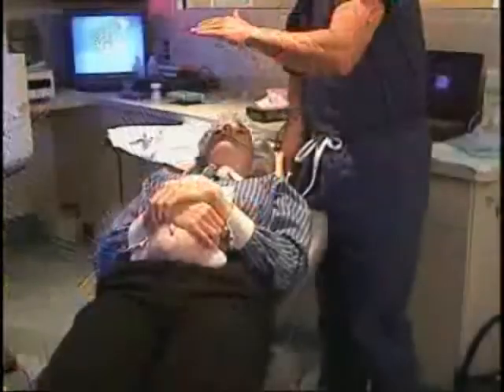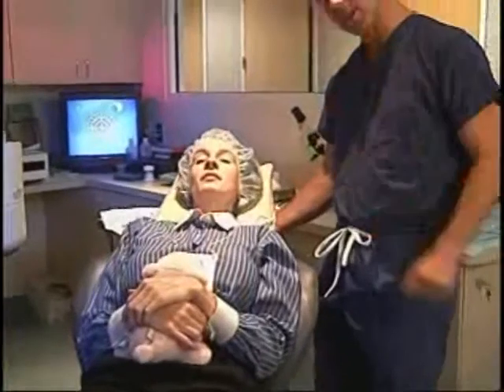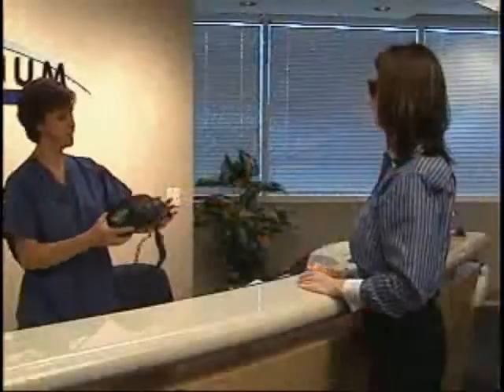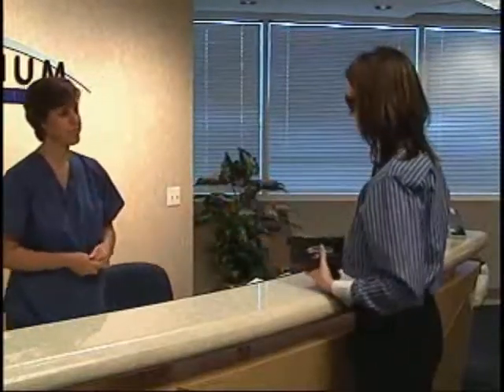Immediately after the procedure, when you sit up, your vision will probably seem improved but will be very blurry, similar to looking through Vaseline on your glasses. However, visual recovery is rapid and most patients will see well enough to drive the very next day. After leaving the laser suite, you will be escorted into an exam room for a final examination, given your medication bag in exchange for your name badge, and then released to go home.